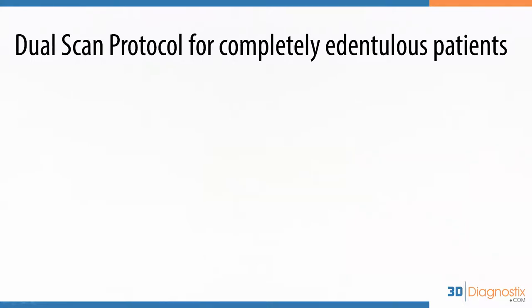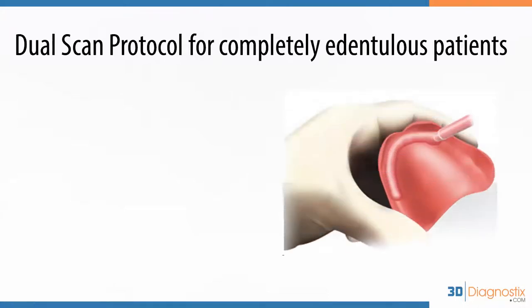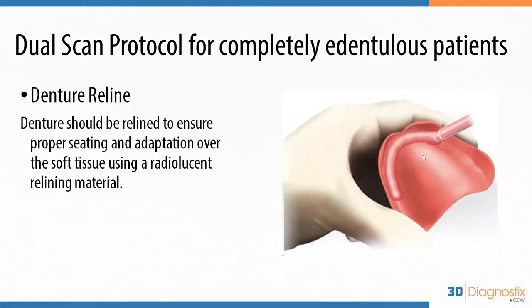When it comes to completely edentulous patients, the dual scanning protocol is composed mainly of a denture, or you'll need to reach a point where you at least have a denture base with occlusion blocks. If a patient walks into your office with an existing denture, this patient is a gem. You will need first to reline the denture just to make sure that it has a perfect fit to the patient's soft tissue, well adapted everywhere. And our recommendation is to use a radiolucent reline material.